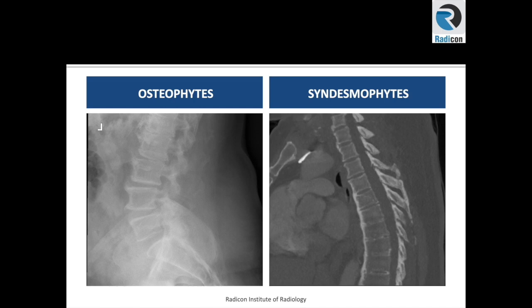On the left, these are osteophytes, while on the right, these are syndesmophytes. Osteophytes on the left are degenerative in origin, while syndesmophytes on the right are inflammatory in origin.